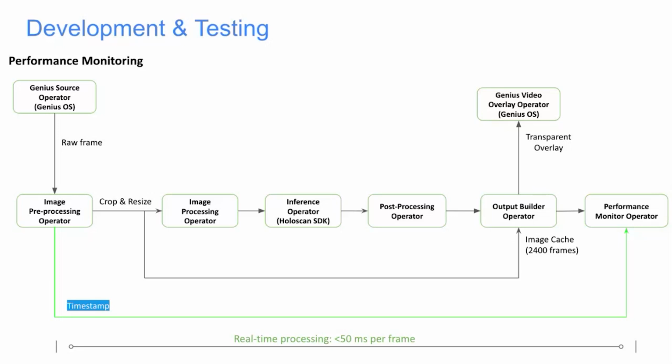This we found very useful. Since our requirement was to finish the pipeline within 50 milliseconds, we added another edge in this graph, which transmits the timestamp at which it received the image and the time it took for the output builder to finish its work and create the transparent overlay. Overall, this helps us not just monitor that our pipeline is healthy, but it also mitigates the risk for the clinicians. If they see that the AI is lagging or something is wrong with the system, they can quickly shut it off.